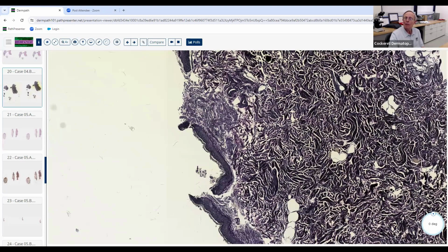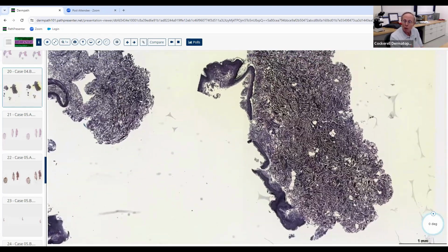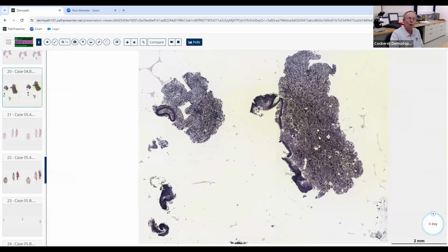And see these little pockets of subcutaneous fat up here? You can get fat metaplasia, but in this case, this was really due to the subcutaneous fat being kind of herniated up into the dermis. And when you see these patients clinically, they have sort of these outpouchings. It's kind of a pseudo tumor. And you walk up to them, you stick your finger in, it's like sticking it into a balloon that's halfway inflated. You can just push it right into their skin because it's really totally atrophic.